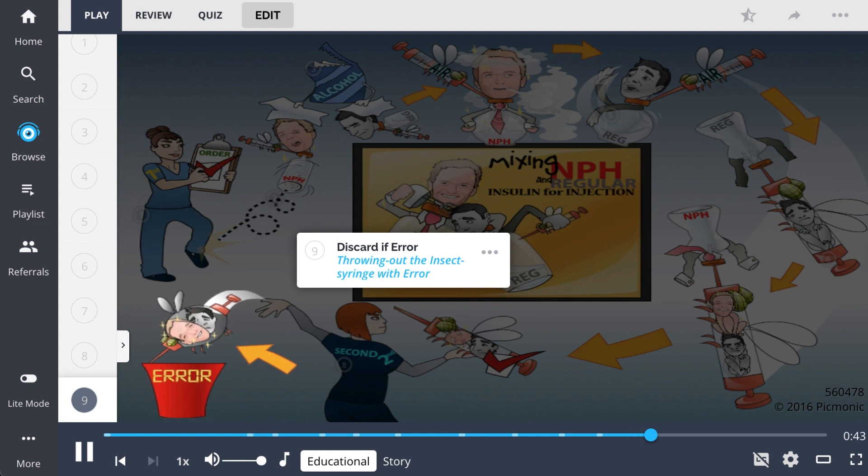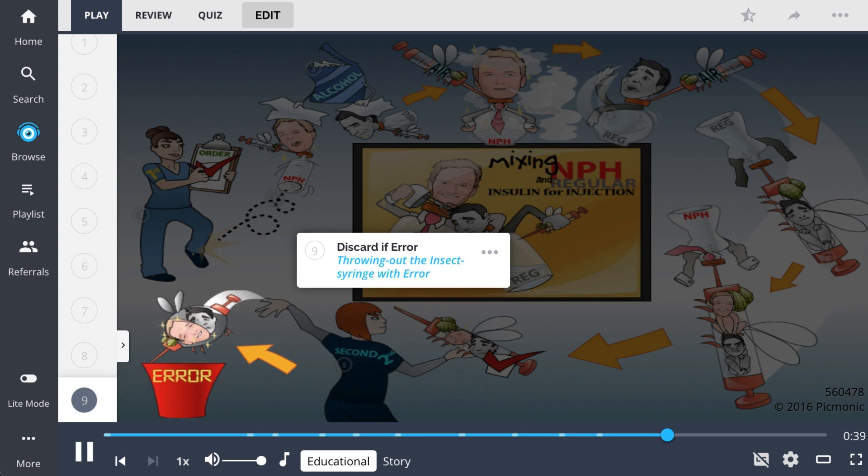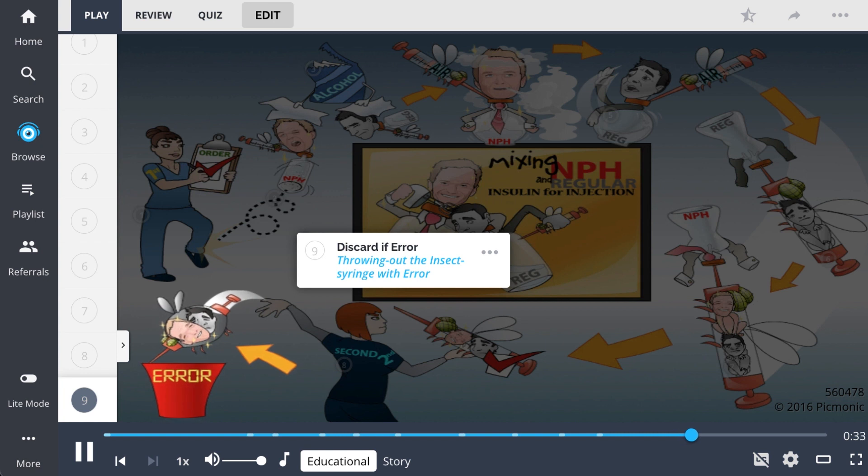So to recap, mixing two insulins like moderate acting NPH, which is cloudy, and a shorter acting regular insulin, which is clear, into one syringe for injection is a fundamental skill.